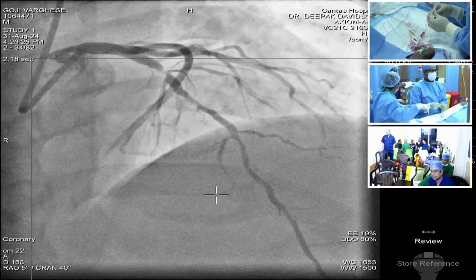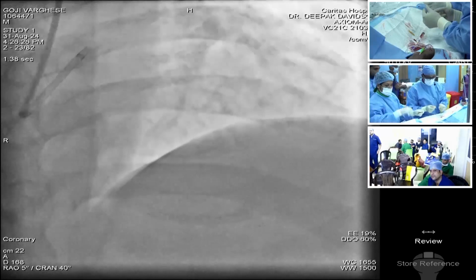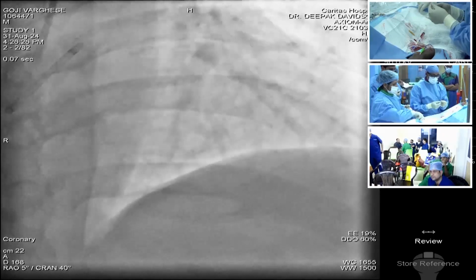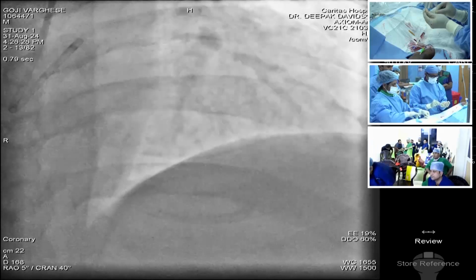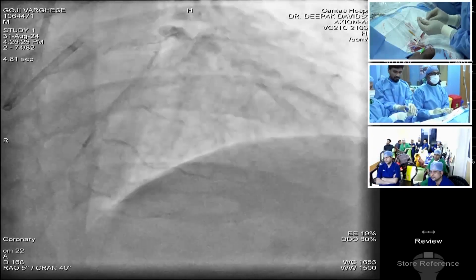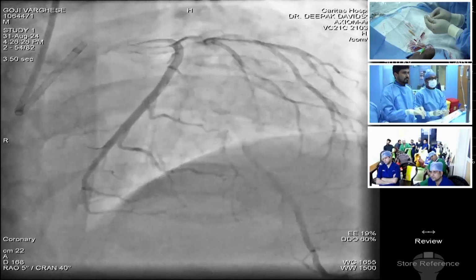This patient, a young person, has had an ACS with ischemic left ventricular failure, and had undergone angioplasty to the circumflex as well as the right coronary artery. Now he has an LAD proximal tight lesion, which doesn't appear to be heavily calcified, but distally the vessel appears to be calcified in the distal segment beyond the diagonal branch.